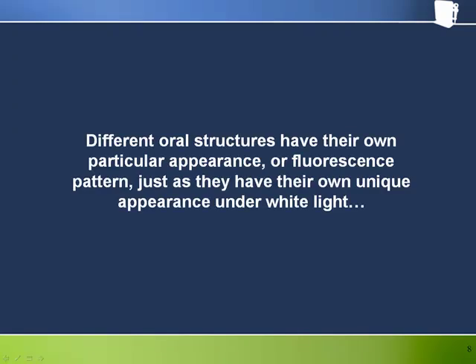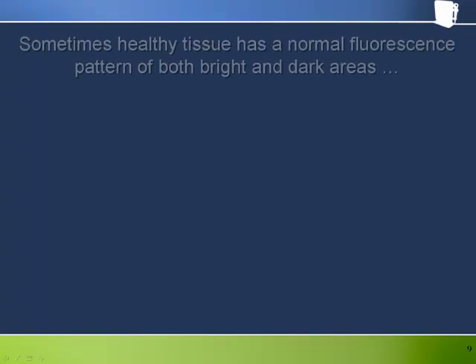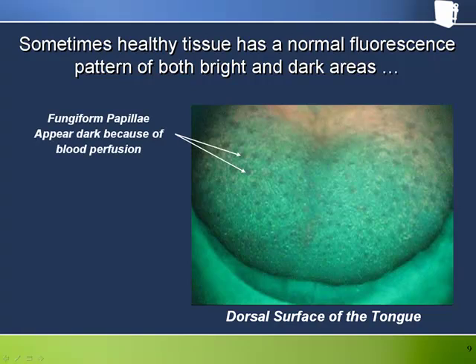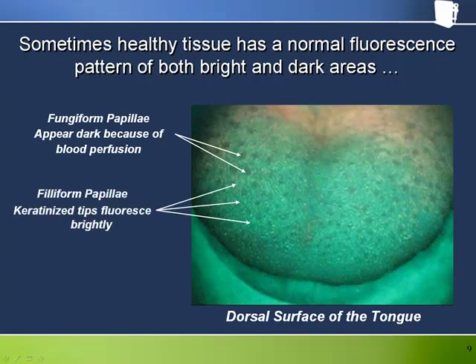We have to remember that with fluorescence visualization, different oral structures have their own particular appearance or fluorescence pattern, just as they have their own unique appearance under white light. Here we see healthy tissue with a generally homogenous pattern of bright and dark areas. The dark spots are the fungiform papilla, which appear dark because of blood perfusion and the lack of much keratin, and the smaller bright spots are the filiform papilla, which have keratinized tips that fluoresce quite brightly under Velscope.